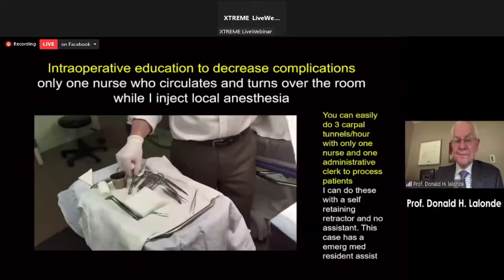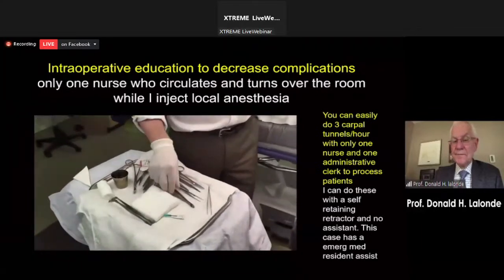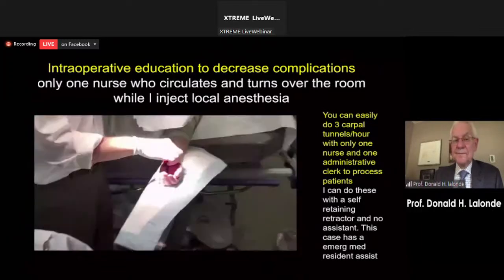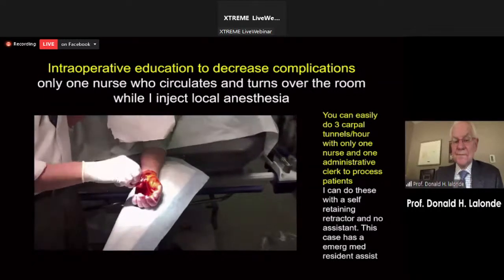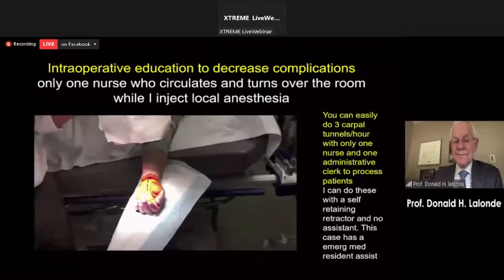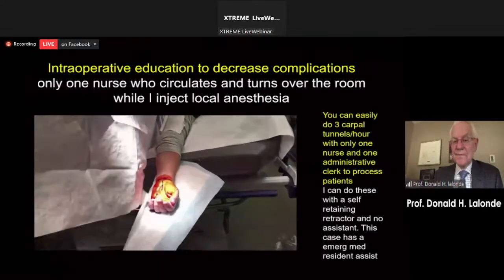Standard tray for carpal tunnel, forceps, little driver, little prep solution. Swing around and show this. Just prep the part that we need to operate. Tomorrow, you can go ahead and get in the shower and wash all this brown stuff off, eh? And I'm just going to cover your wound here a little bit.